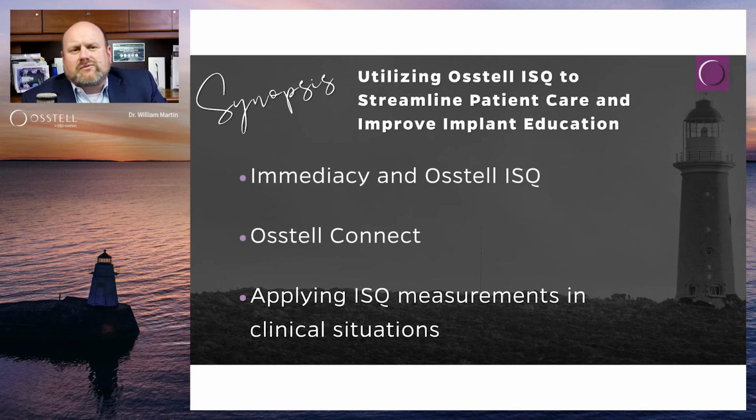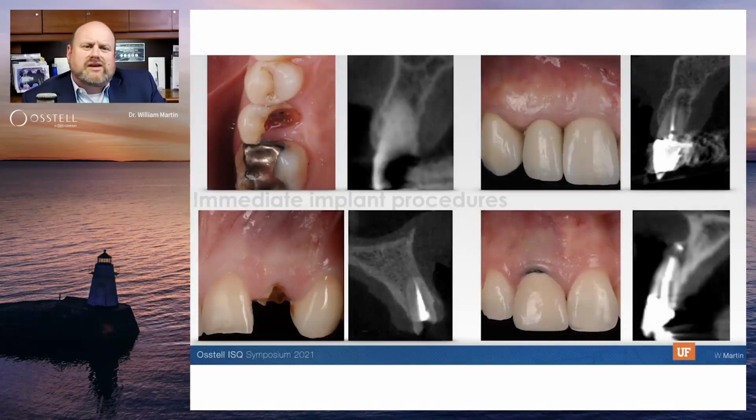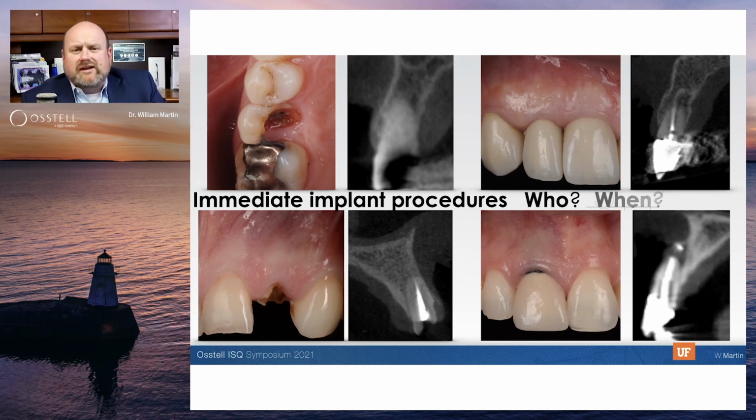The first thing that is important when we are evaluating patients for implants and the potential for immediate implants and loading is who are the best candidates for this, when can we do these procedures, and how are they executed. So we have 4 patients on the screen here, and all these patients probably present with different risk factors associated with doing immediacy, and some of them would be good candidates to proceed with that process, and some would not.